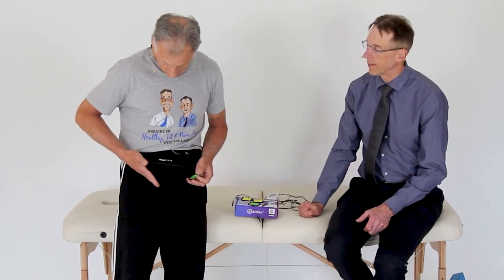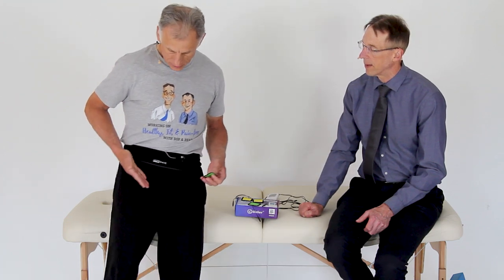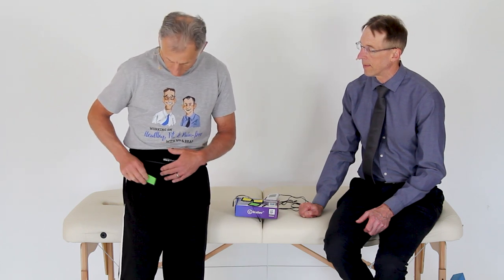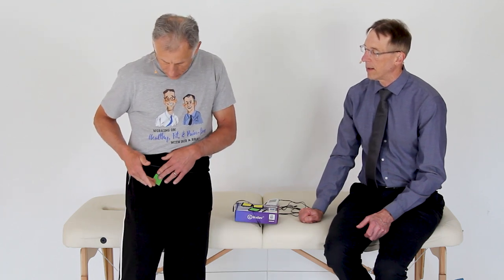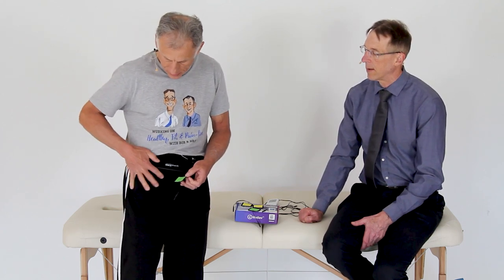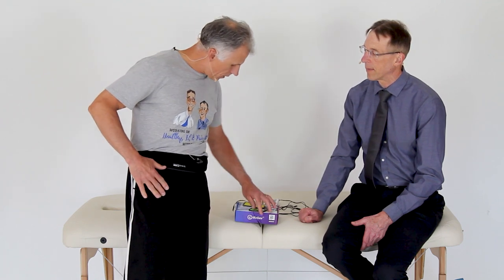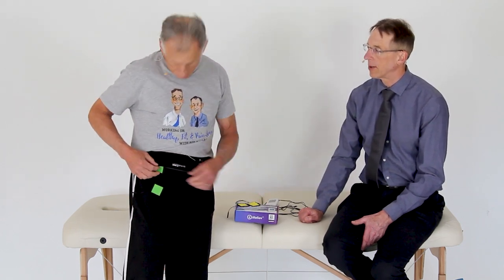One thing you have to be very careful with is the femoral crease, which is right here, the part which bends. You do not want to put a pad over the skin there, because when you bend it, it's going to interfere with the connection of the electrode. So you're either going to go above the femoral crease or below it. If that hip pain is right here, we can't go right on it. We're going to go above, and this is assuming that you're going to be active. If you're going to lay in bed, you could put it on the crease.